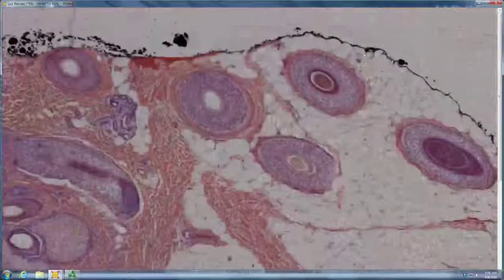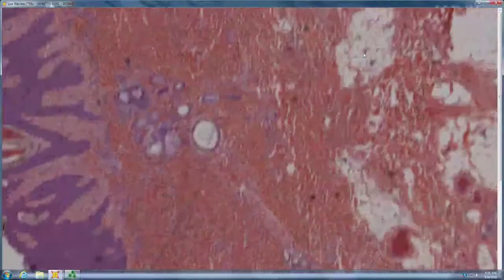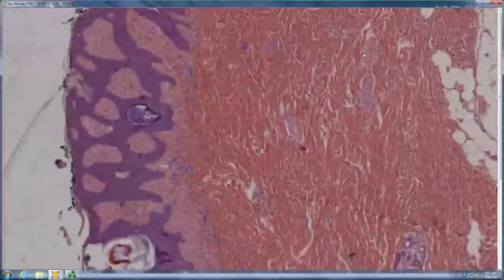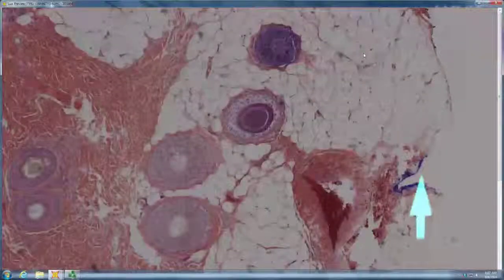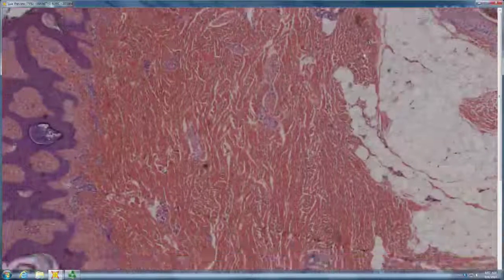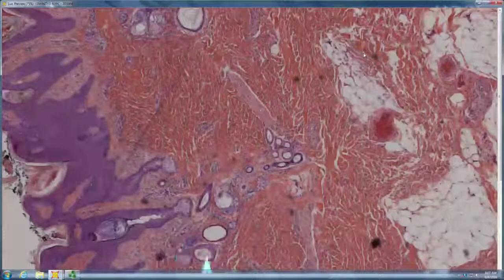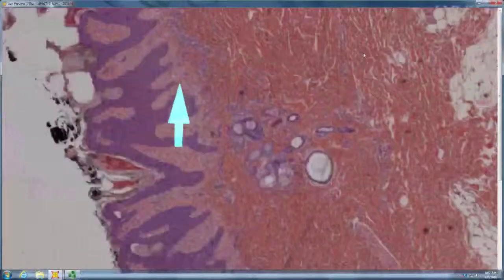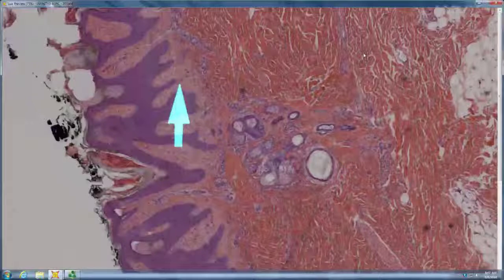So first off, where do you think you are? Scalp. Scalp, and then what is this? Plenty of hair. Yep. In the center, is there any hair? No. Epidermal nevus. And there are these little things that look kind of like attempts to make hair follicles. So it's broad, it's bald, but it's not bumpy and it's not bubbly.